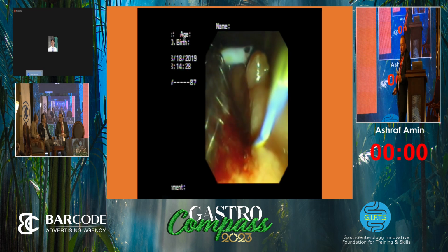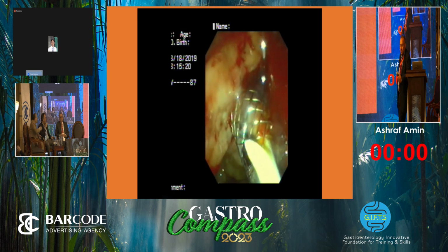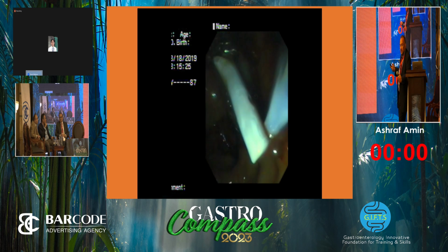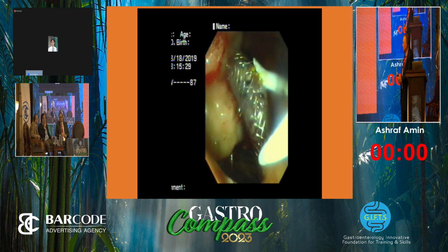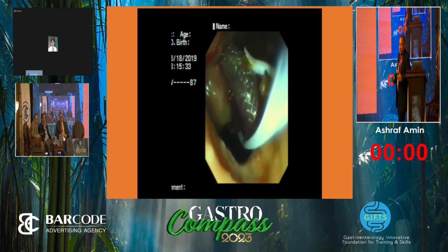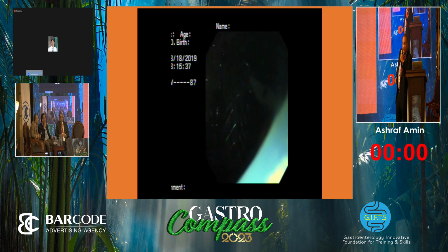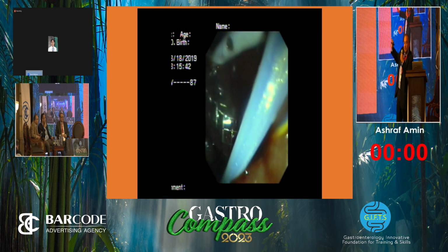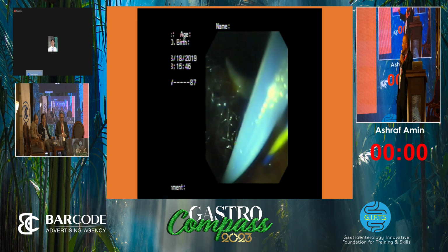And the question here is why he did it through the intervention radiology before ERCP. From the beginning, he referred to the intervention radiologist. That's why we prefer the rendezvous technique. Even if we can puncture it, we can see the papilla, we can see exactly where to insert the metallic stent, or ERCP.